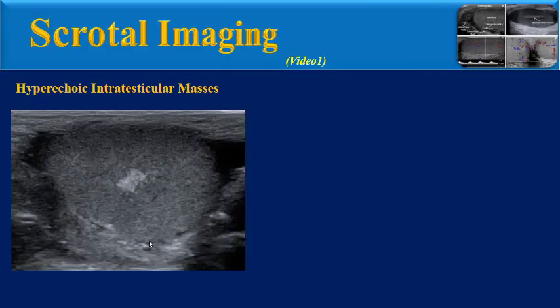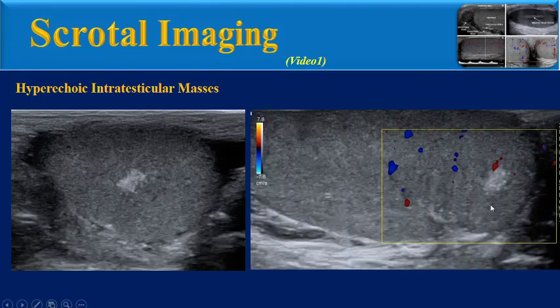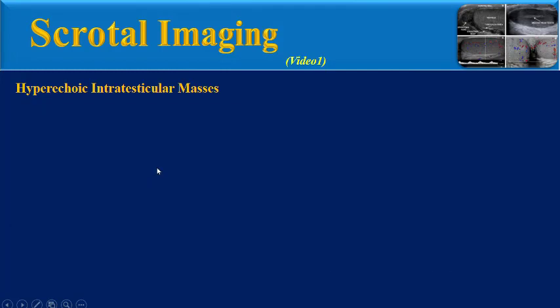During scrotal ultrasound, we may incidentally encounter intra-testicular hyperechoic lesions without any vascularity on color Doppler ultrasound. The patient has no symptoms and no palpable mass on physical exam. These findings are suggestive of hyperechoic intra-testicular masses. What is the differential diagnosis of these hyperechoic intra-testicular masses?